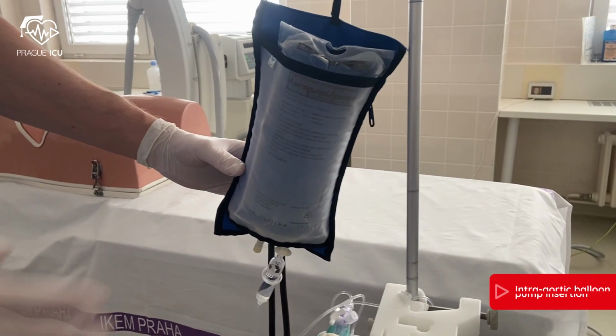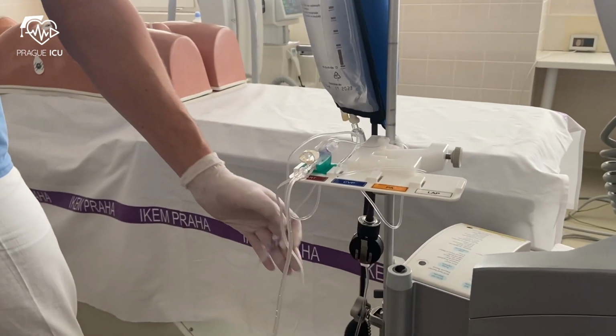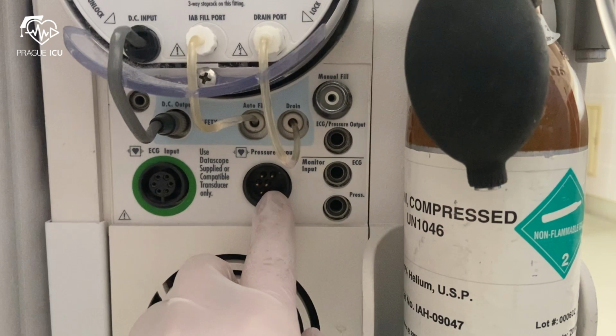Before the procedure, prime and hang a single transducer setup. Then connect the transducer cables between tubing and console. Attach the end of the cable here to the pressure input slot.